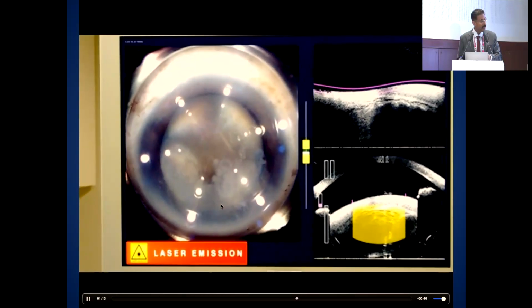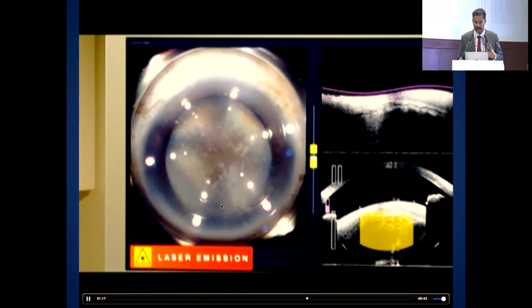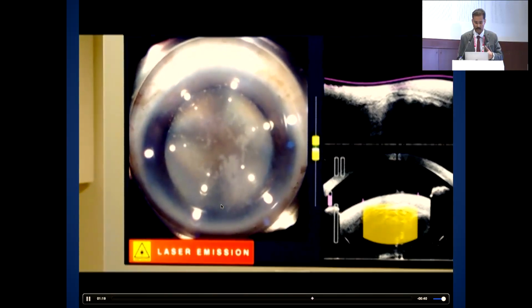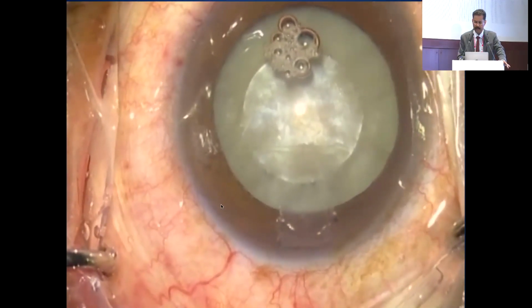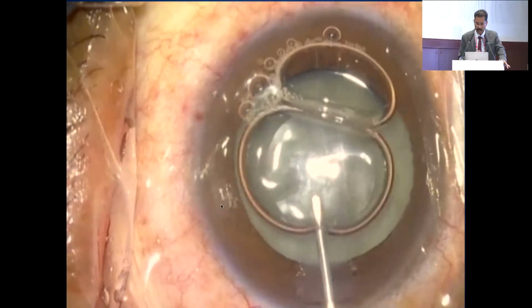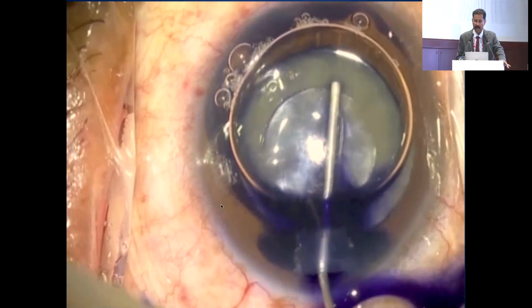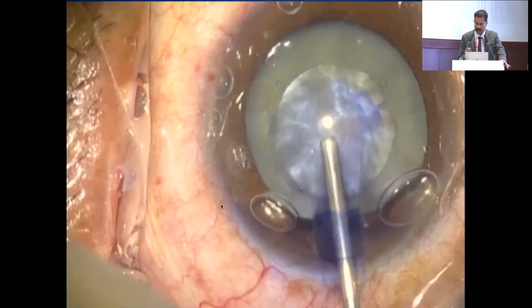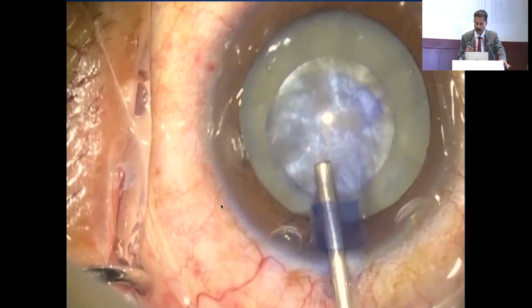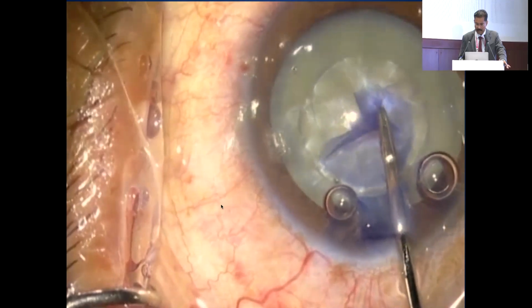See, this is the way you can have the milky cortex coming out into the anterior chamber, and then the laser passing through will be more difficult, and you will get incomplete cuts. So whenever I do a mature cataract, I always stain over the capsule, so that I can identify where there are connections. If there are connections, I would just not pull. Sometimes if you pull, you may leave tags there. So I will just include that area also and take it out.